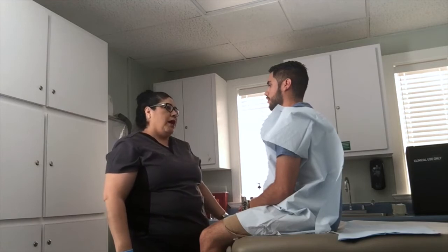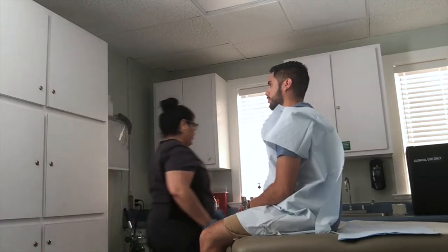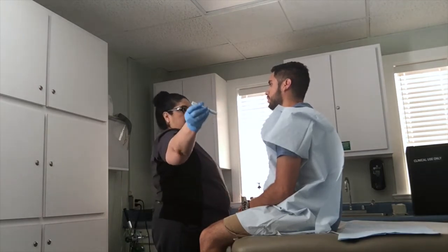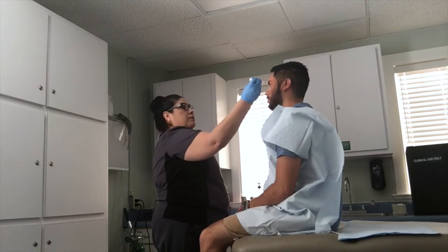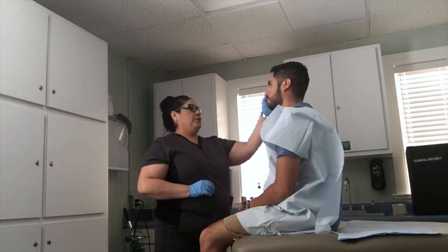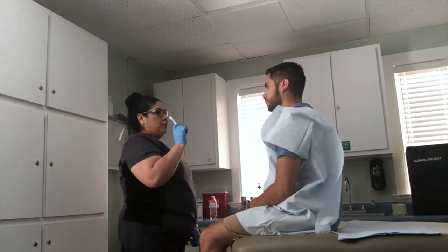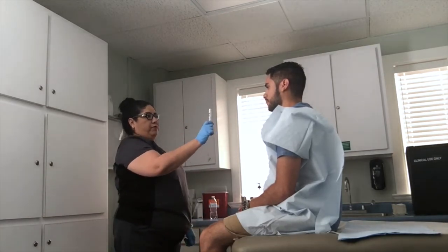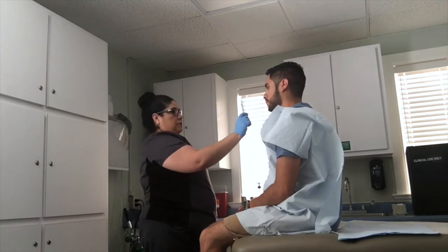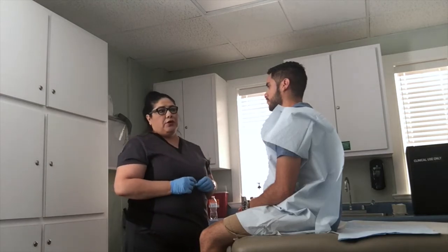I'm also going to be checking his eye function. I'm going to be testing his pupillary response to light and accommodation. Okay, I'm going to check your eyes coming in with the light. Okay. I'm checking his pupils. Very good. Now I'm also going to check for accommodation. So you hold it about 12 inches. Very good. And I want you to follow this. Very good.